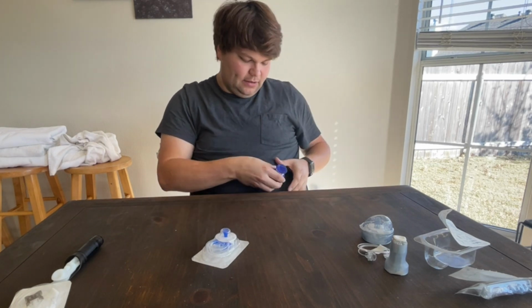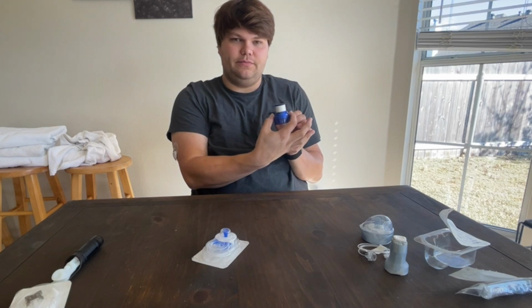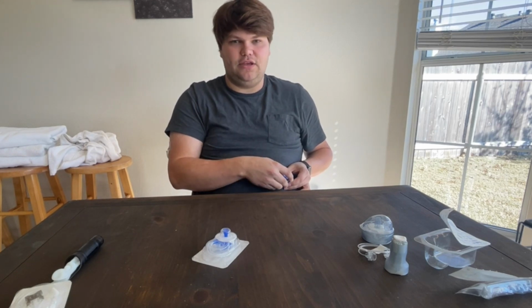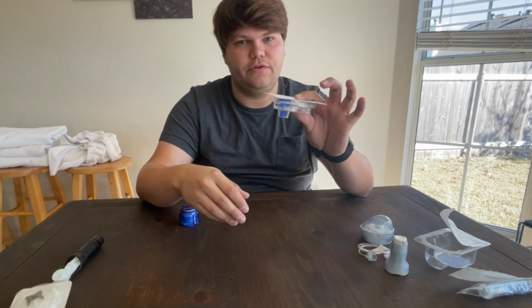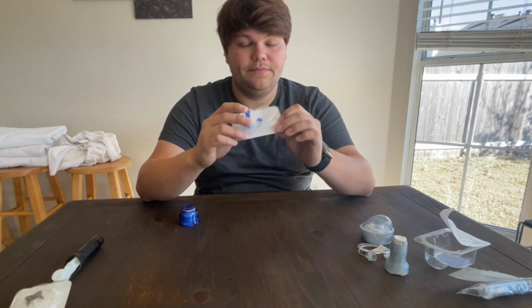Then you just take it, place it over the skin where you want it, pinch these two white clip pieces on the side, and it inserts, and then you can work the inserter off and then pull the blue piece, and it will remove the needle from the infusion set, and then you'll go through your priming process like that.